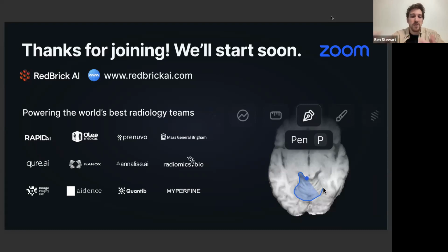And we are the software by which teams such as these, and others, are creating ground truth data of exceptional quality. So we are very happy to be dedicated to the medical niche, the world of radiology AI, for diagnostic and visualization purposes.